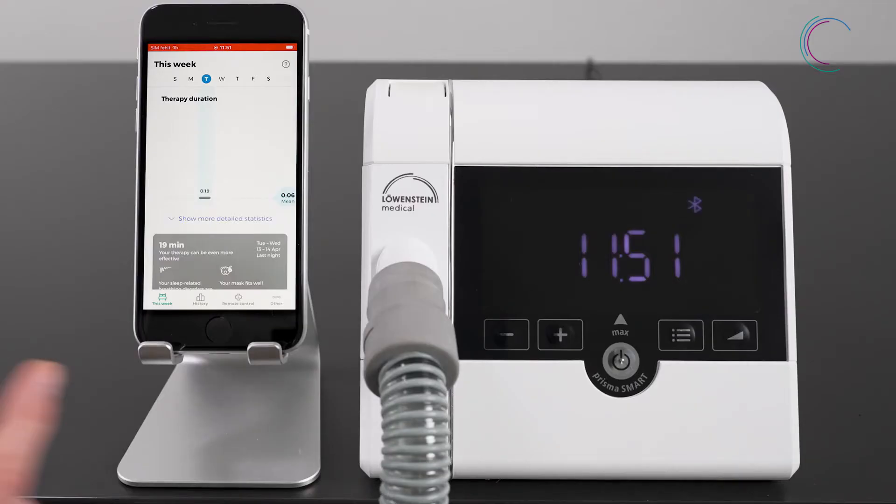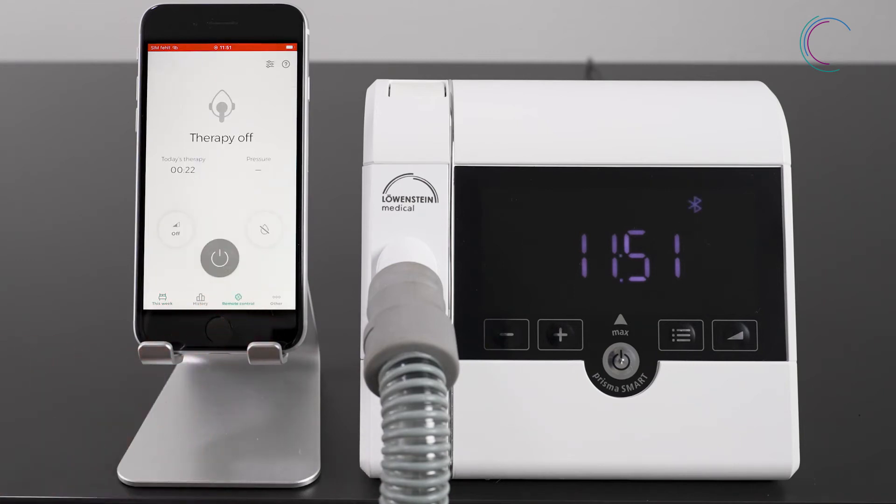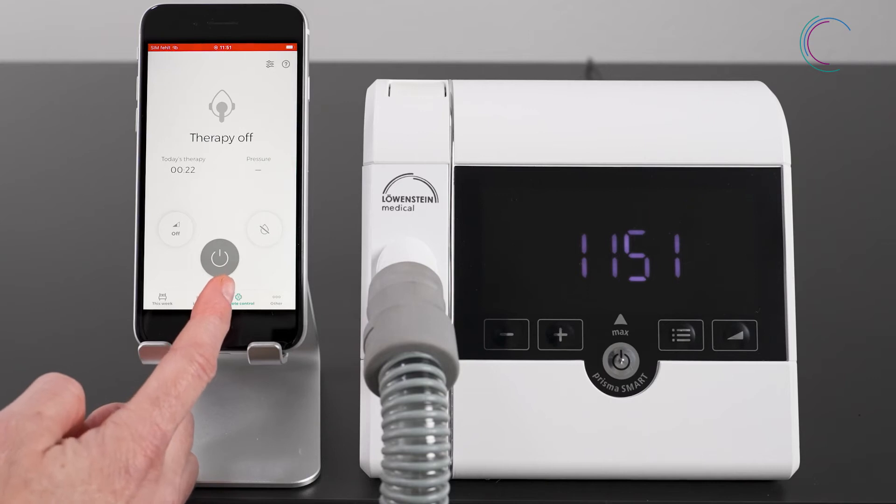To start your therapy out of Prisma App directly, go to the screen Remote Control. Press the on-off button and the therapy will start.